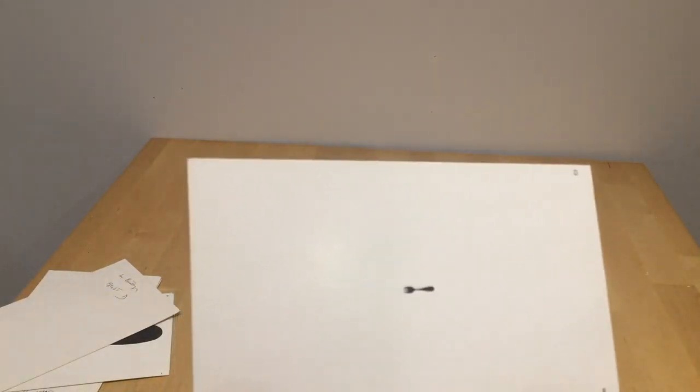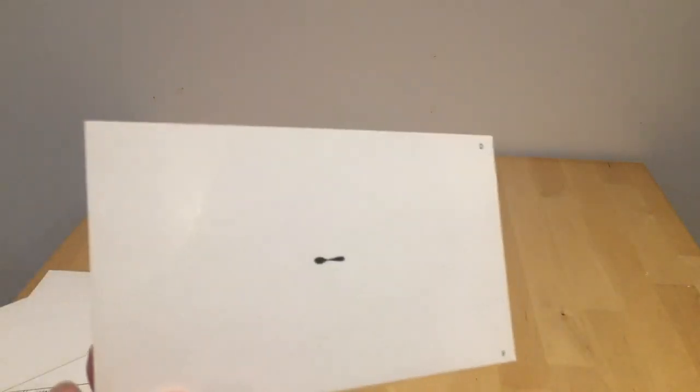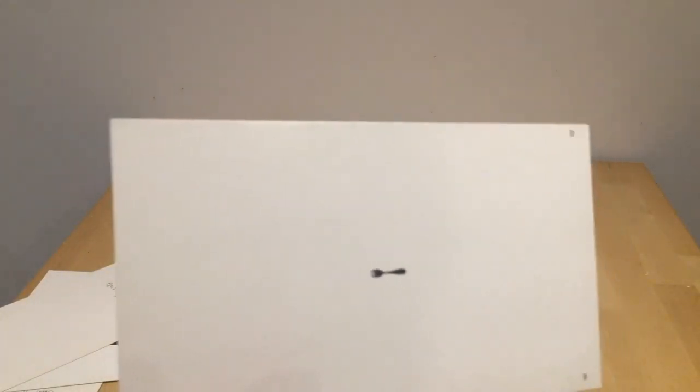Whichever distance that you choose to do, please maintain it for the whole of the test. Don't move forwards. But here is set 9, fork. And again, as with the near test, when it comes to errors, it's more likely to occur between the fork and the spoon, with the tines of the fork blurring together and the child or young person mistaking it for a spoon.